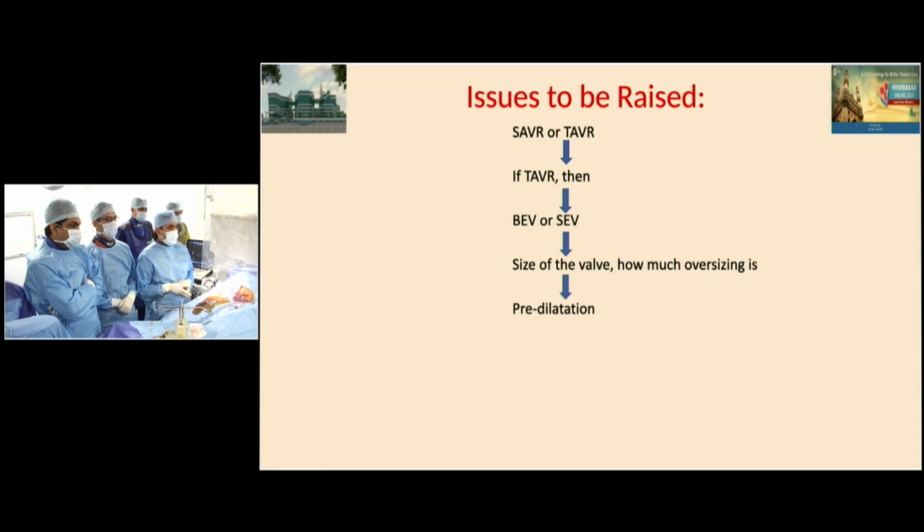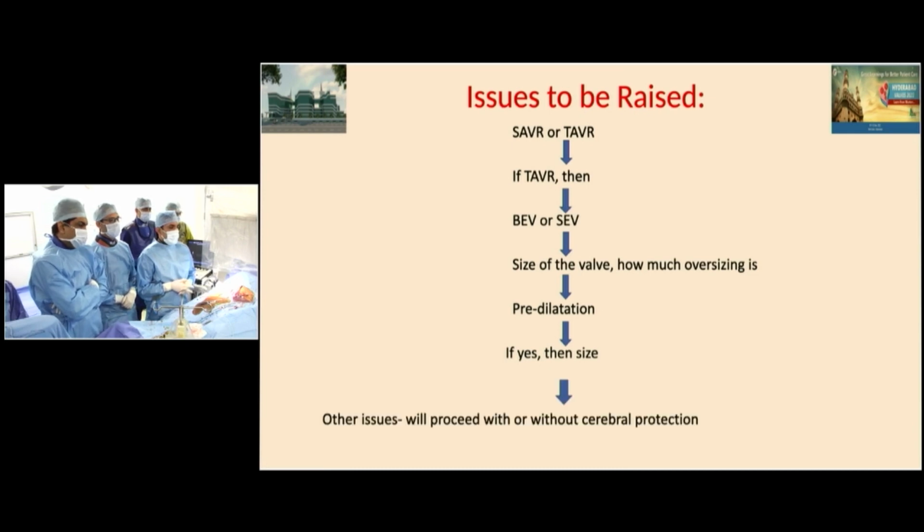Pre-dilatation, yes or no. In the majority of balloon expandables, we are not doing any pre-dilatation, but here is a situation where mean gradient is 70 and peak is 100. So we'll assess it during our crossing and assessments. Our pre-dilatation balloon is 23 millimeters.